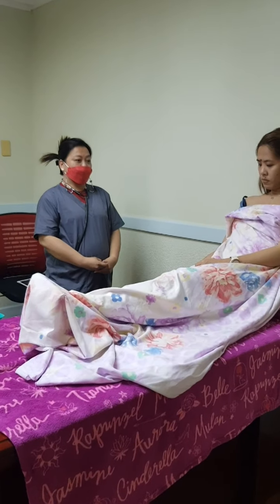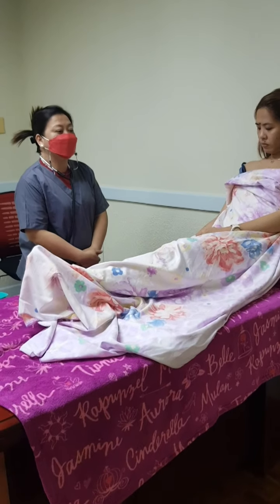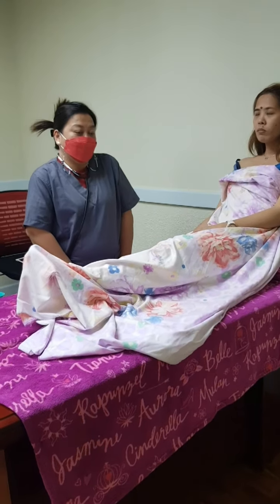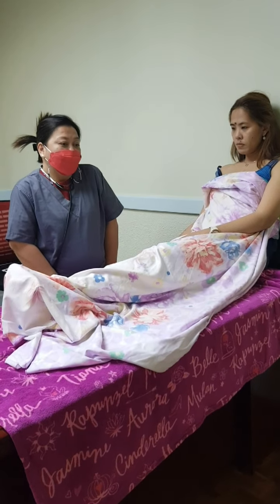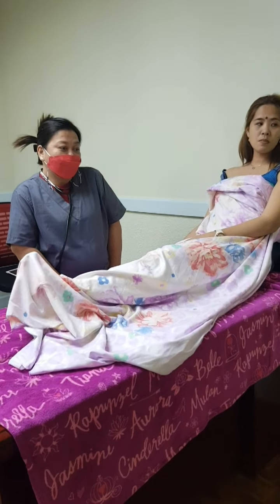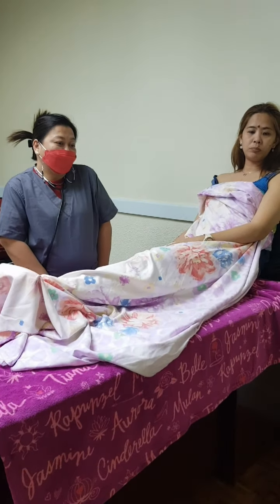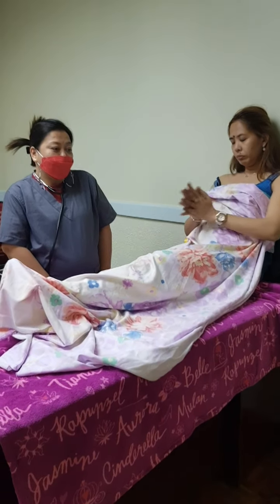Procedure: Check the doctor's order for insertion of the nasogastric tube. This clarifies procedures and type of equipment required. Explain the procedure to the client. Explanation facilitates client cooperation. Gather all the equipment to organize procedures and ensure accurate skill performance.